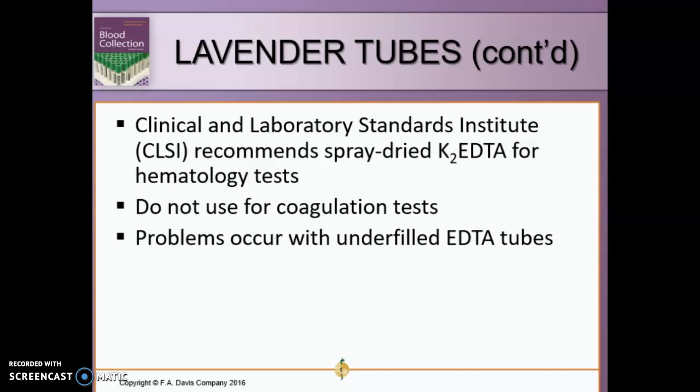If we have an underfilled EDTA tube, the excess anticoagulant may shrink the red blood cells, and it may make the hematocrit level appear to be decreased. So we need to take that into consideration as well.